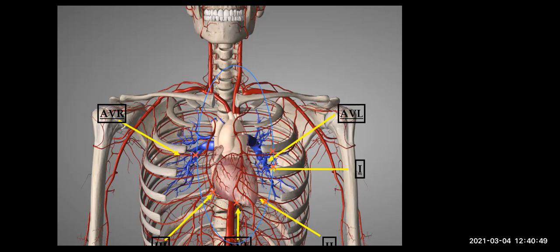Okay. So you've got AVL and lead 1 that are looking at this side of the heart. And this is called the lateral edge. So they are called the lateral leads. And to be more specific, they are called the high lateral leads. AVR is the only one that looks at the heart from the right-hand side. So it's one lead that's on its own. And then you've got leads 2, 3, and AVF that are looking at the heart from the bottom. So these are called the inferior leads. Okay, I hope everybody gets that.